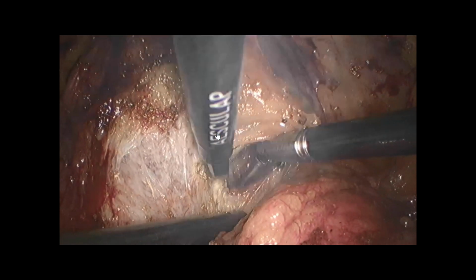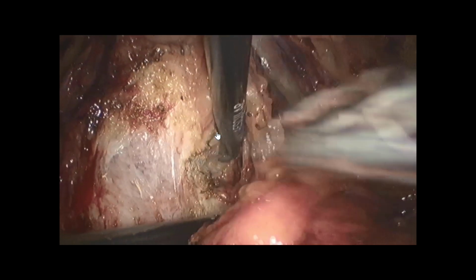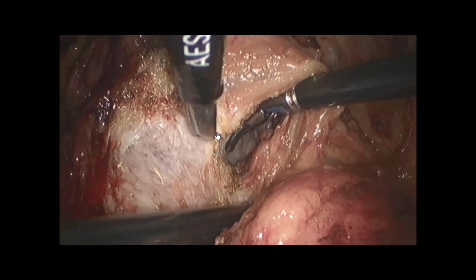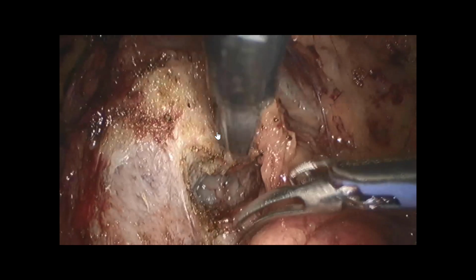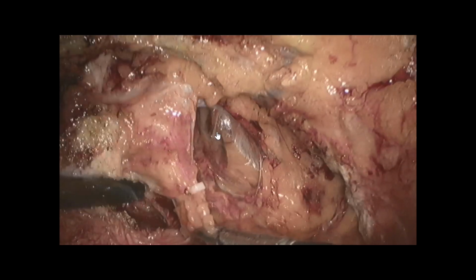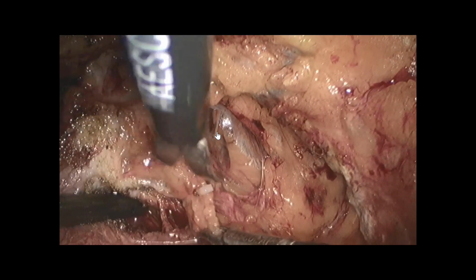What is very important is your assistant. You don't see my assistant. He has 2 active hands. One hand is doing the traction on the bladder, and the second hand is with the suction. And always, when you do this surgery, you have to know that it's teamwork. So you have to know exactly what your assistant must do.